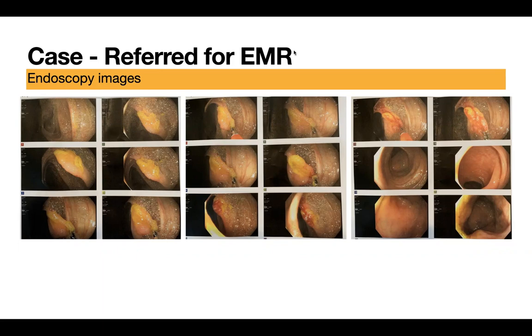I just listened to a webinar from Doug Rex on the ACG website, where he talked about how important it is, when you do photo documentation of the colon, apart from the landmarks, to also clean. If this endoscopist said that the prep was adequate for polyps, and then the pictures all show these bubbles where it hasn't been cleaned, those pictures should not be included.